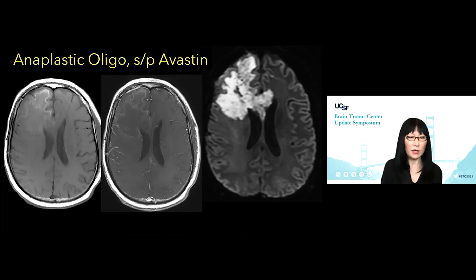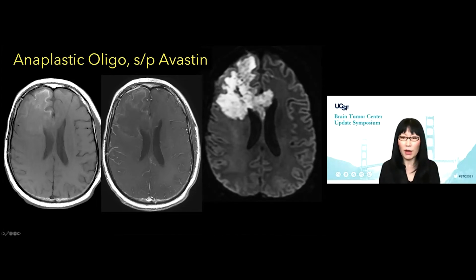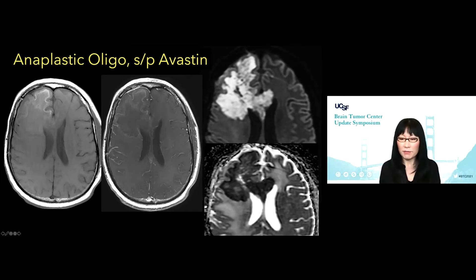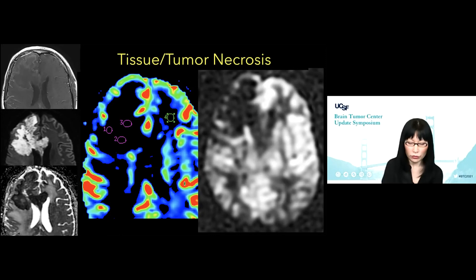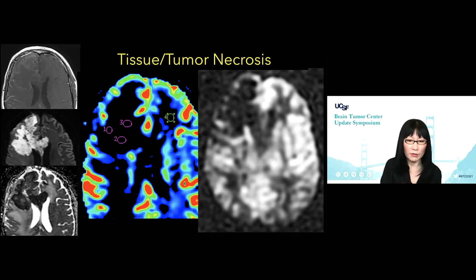How about this patient? Patient had anaplastic oligo and received Avastin. Is this a tumor or what is this on DWI? Here's the ADC map to prove this is true reduced diffusion — we see this quite often post-Avastin therapy. But once we add perfusion, we know that there is no vascularity there. This is a dead brain tumor — tumor necrosis that is completely void of blood flow or blood volume in that region.